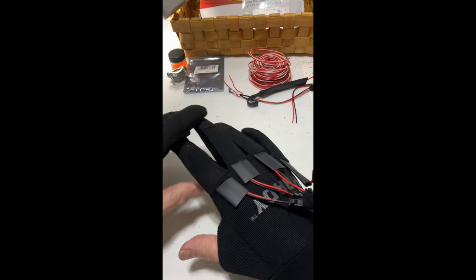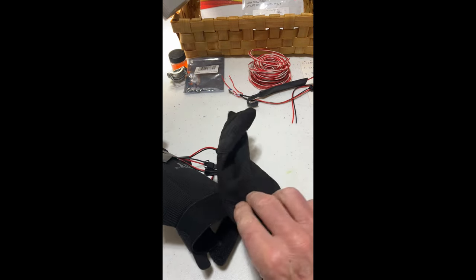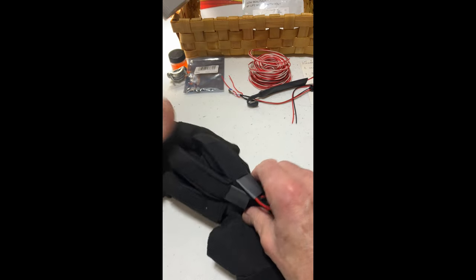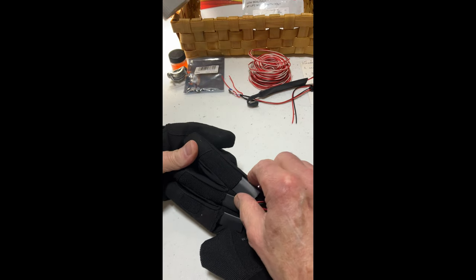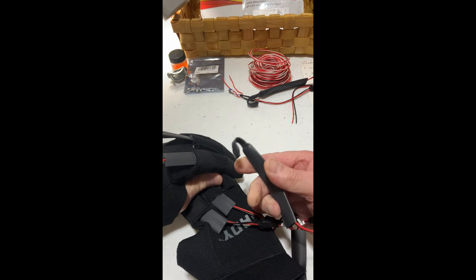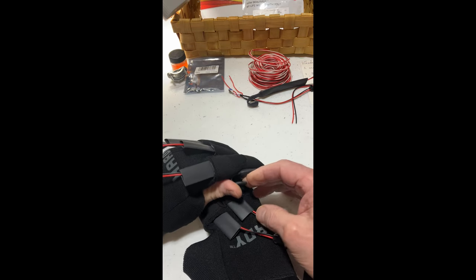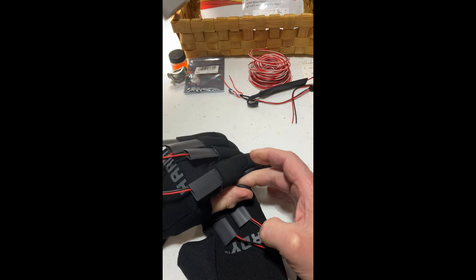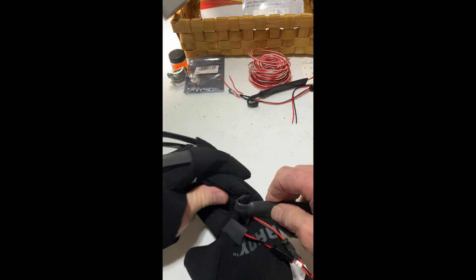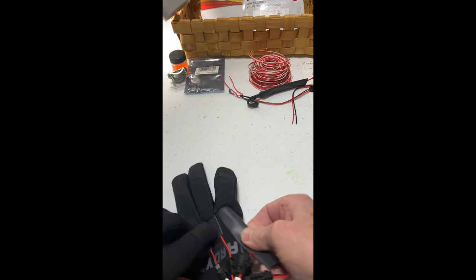The gloves are comfortable and flexible. These are based on a mechanics glove — they've got a little Velcro strap and a flexible foam material. What I've done is encapsulated these vibration motors inside the shrink tube on the end. So when you put your hand in the glove, your fingertip goes right into the little cup there, and then you just slide it back into the glove.